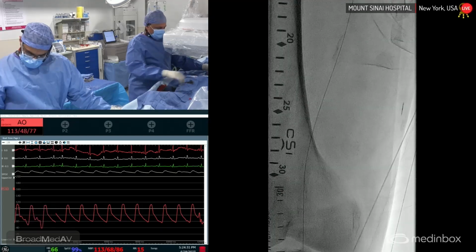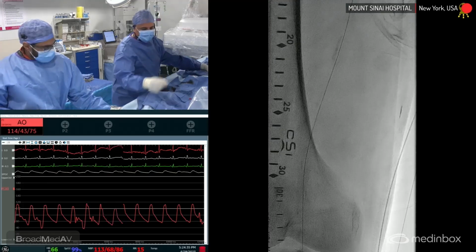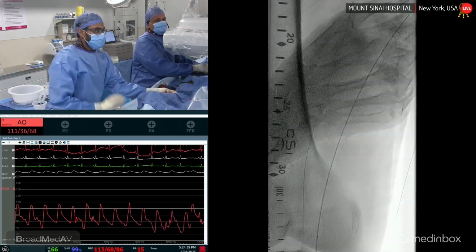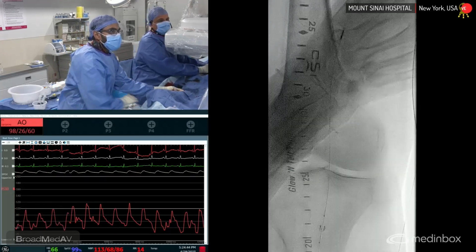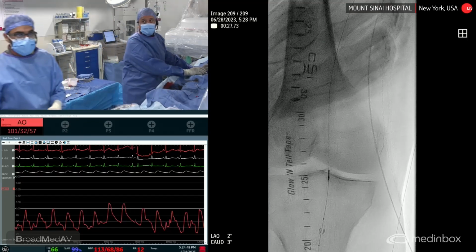There's been one study in JACC that said in DCB the outcomes may be better. But again, it's a randomized control study out of Australia, so very good data. However, there's a lot of criticism of that study for many reasons, which I'm not going to go over at this stage. Okay, let's go live, guys, with the IVUS.